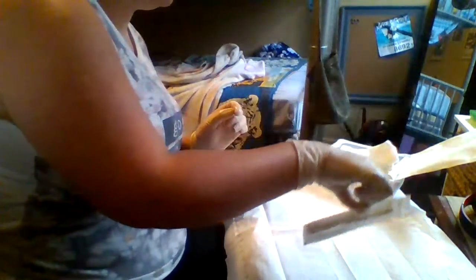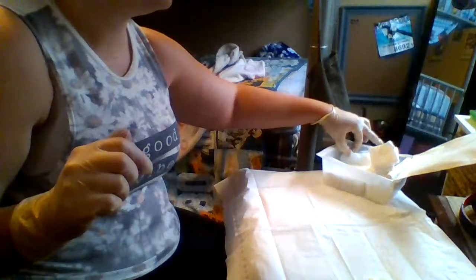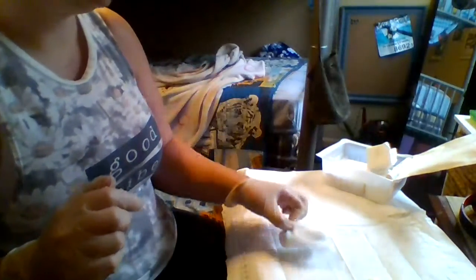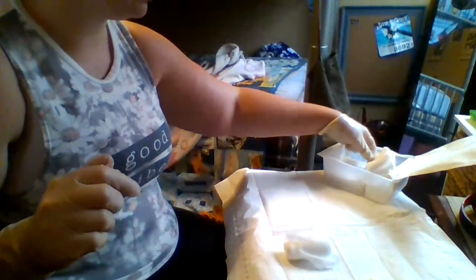So I have my sterile field placed. So I just need to take out my things. You don't want to reach across really. Try not to do that if at all possible. You don't want to get your sterile field wet either, because that contaminates it.